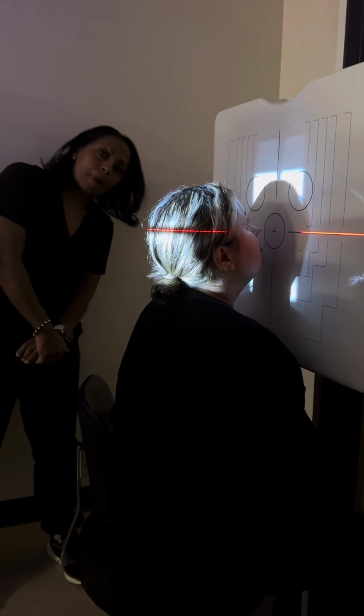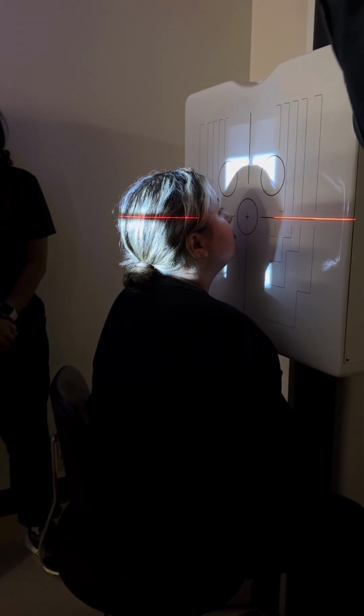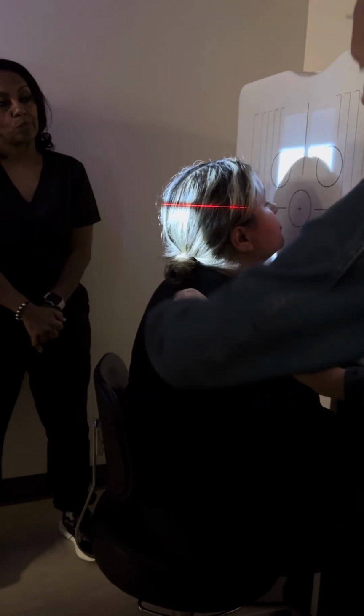We also do it for something that we're going to learn come Wednesday, which is for sinuses. The only difference between this, facial bone, and sinuses is that although we do this projection, we also do one more. I just want to show you in a continuum why we're doing all this.